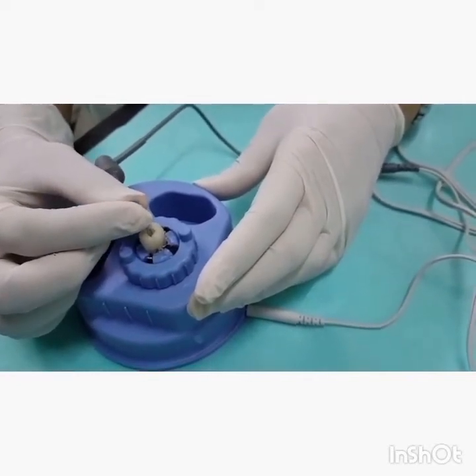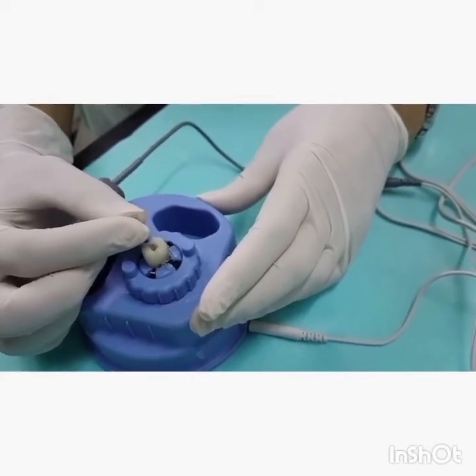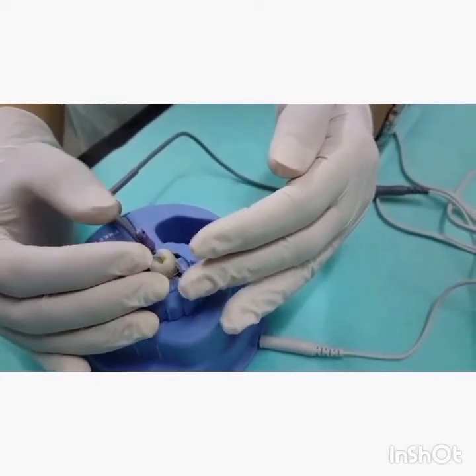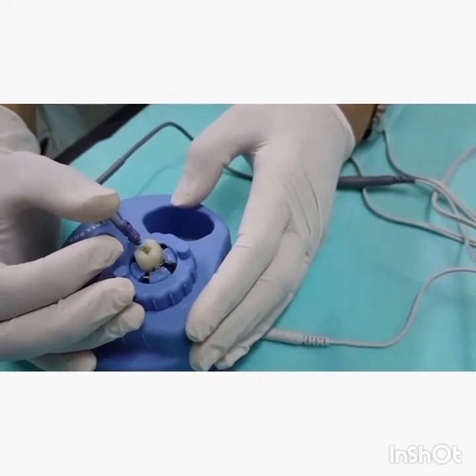Make sure the pulp chamber is dry. The canals can be lubricated, but there should be no exchange of fluid between the canals. Also ensure that there is no flow of saliva from the external surface. Now we are ready to determine the working length.